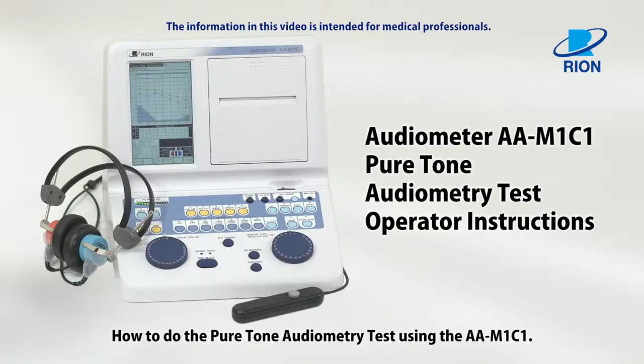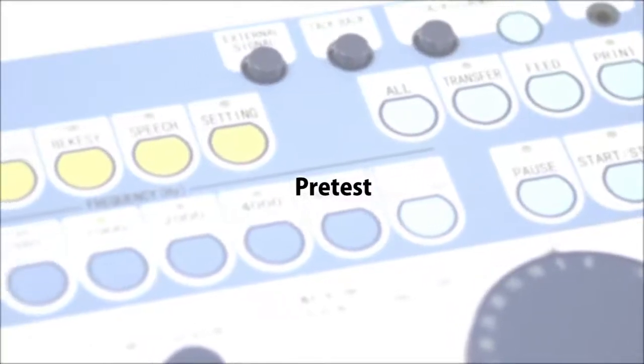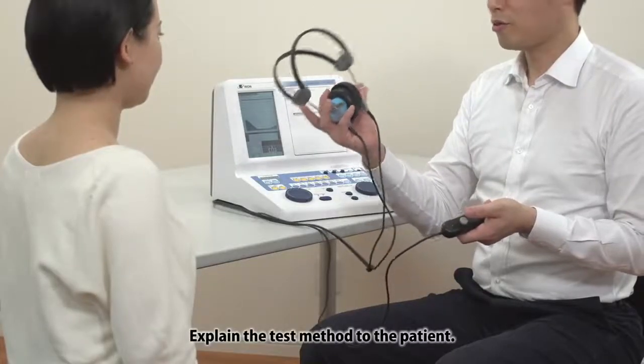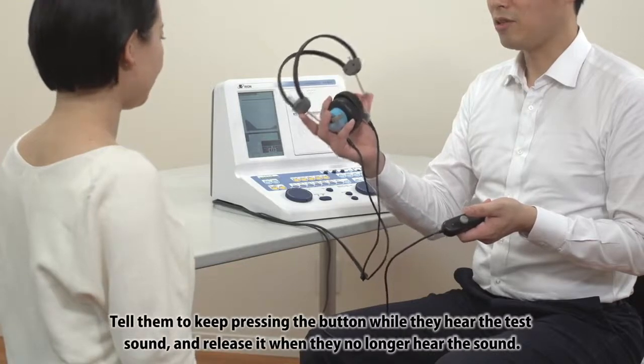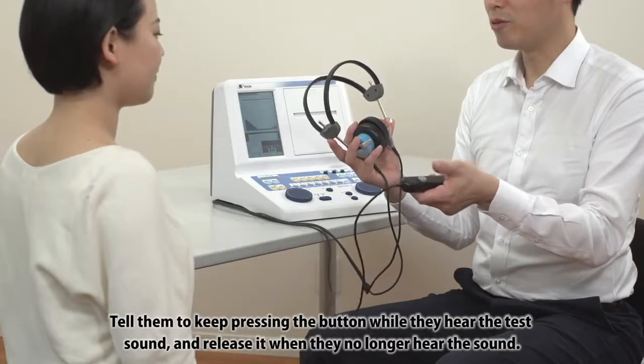How to do the pure tone audiometry test using the AA-M1-C1. Pre-test: Explain the test method to the patient. Tell them to keep pressing the button while they hear the test sound and release it when they no longer hear the sound.